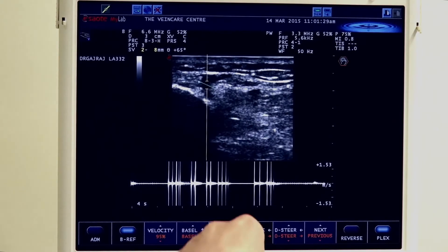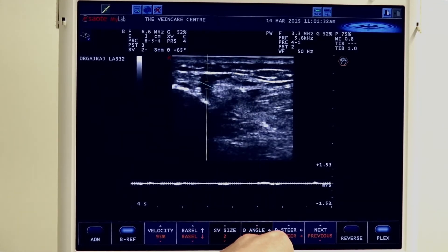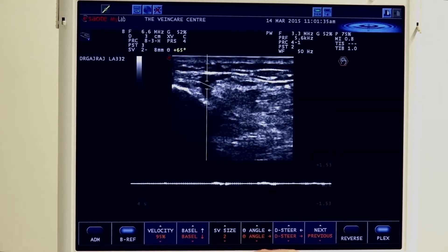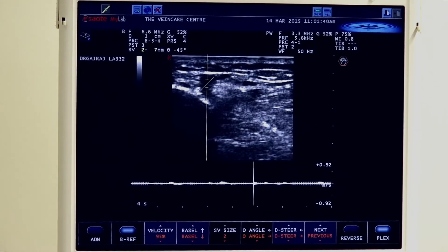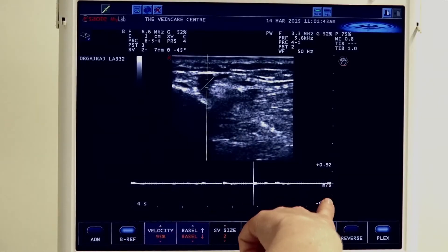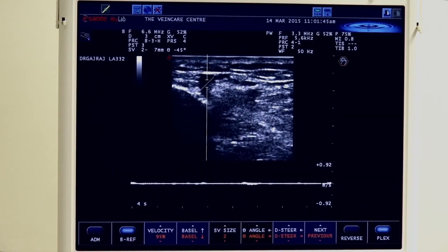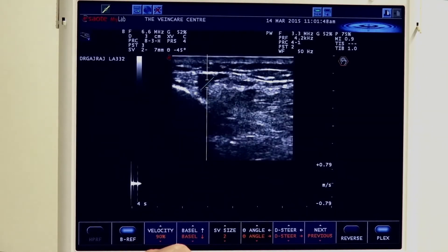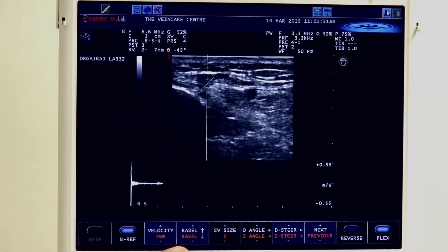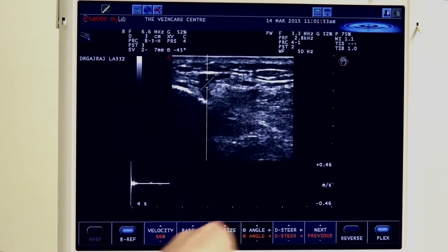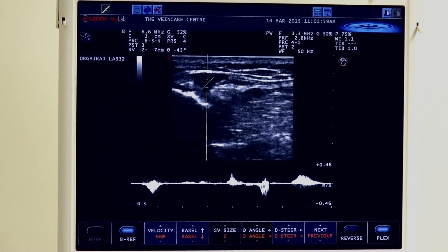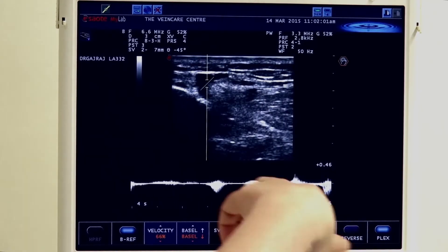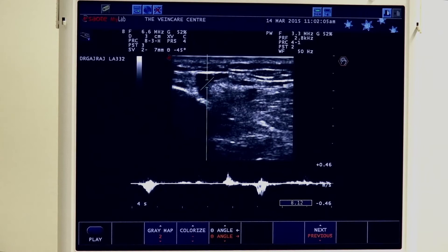To do that we're going to angle to the level of the vessel walls, ensuring the angle is less than 60 degrees. We're going to reduce our frequency to ensure that slow flow within that vein is adequately detected. And again, a good squeeze just distal and release. We can see we have a short little burst of incompetence but again less than 0.5 of a second and not significant.